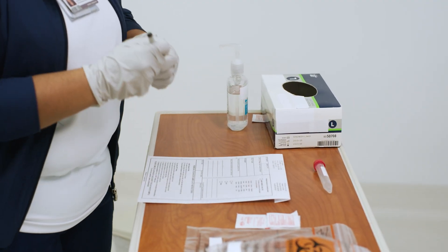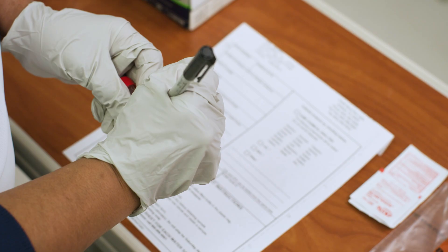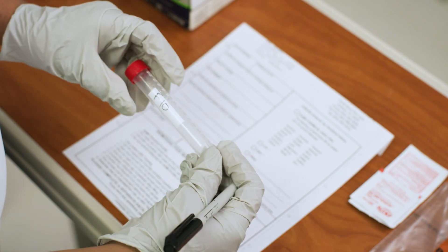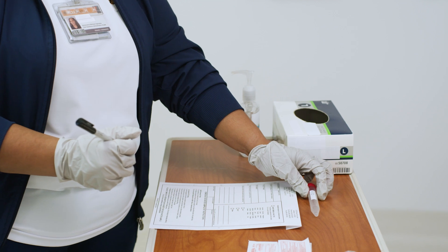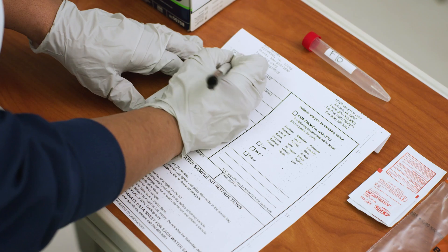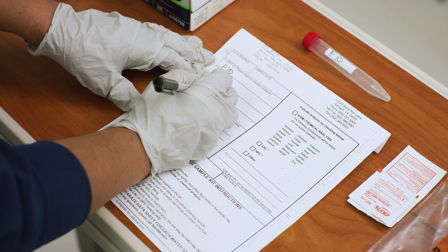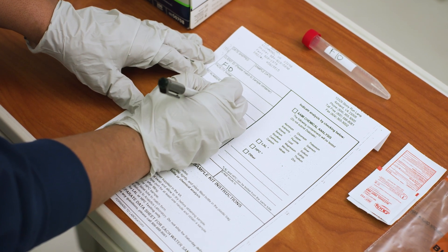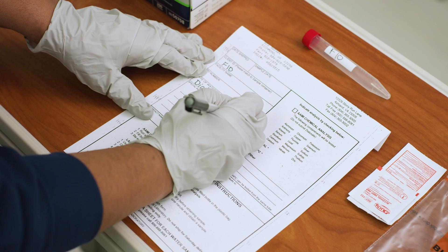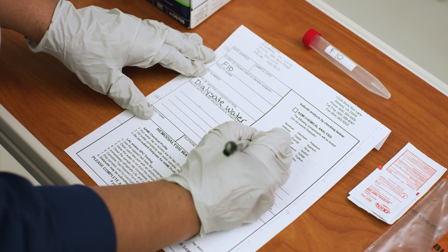With a permanent marker, label the sterile test tube with the name of the machine you'll be testing. Fill out the log sheet, and be sure to check the appropriate boxes to indicate which tests will be performed. In this case, we'll be testing the dialysate fluid for microbials and endotoxins, and should check the boxes for LAL and HPC.